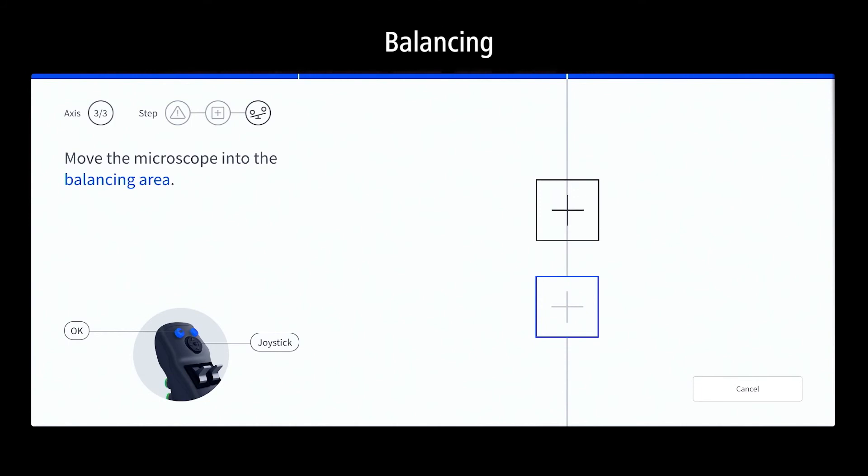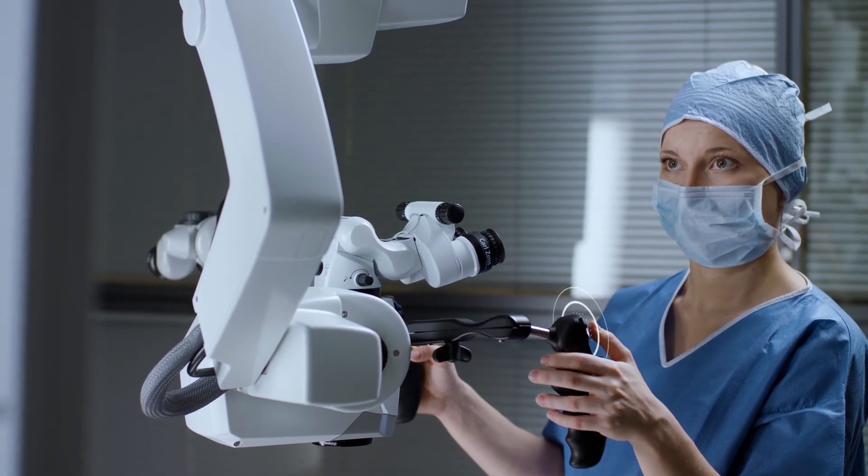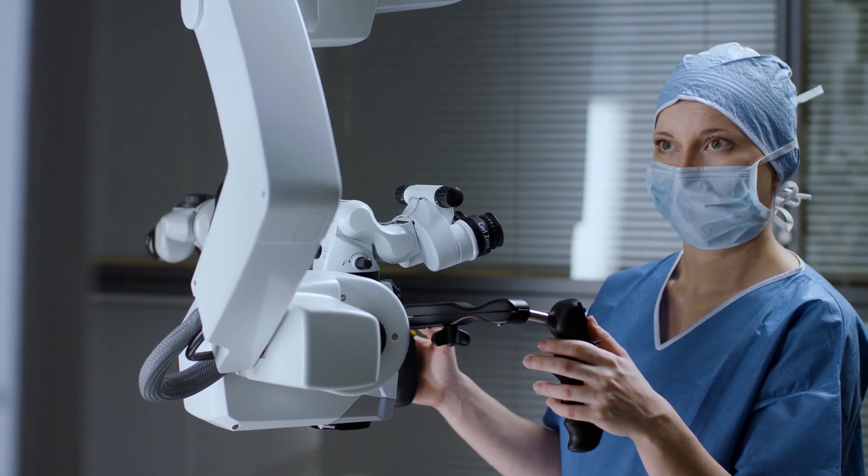Move the system to the second spot and check the balance. Adjust the fine balance by tapping the joystick up or down. When balance is reached and the system is free-floating, continue with OK.